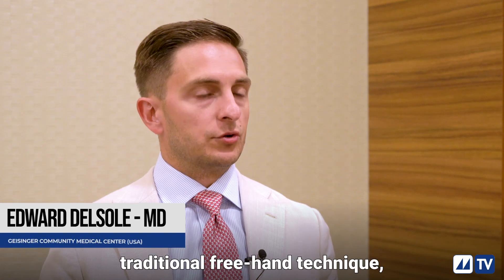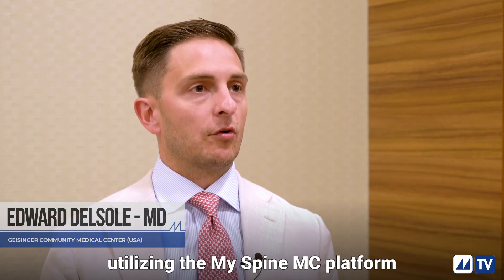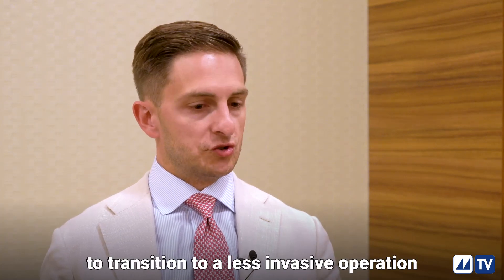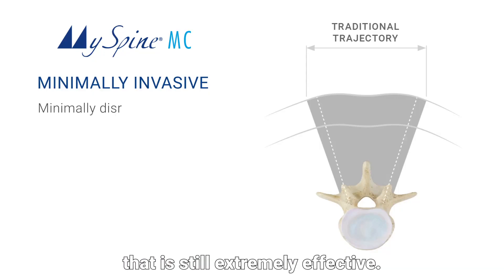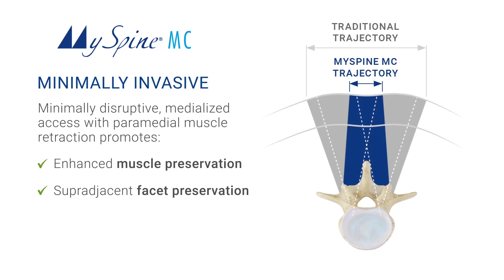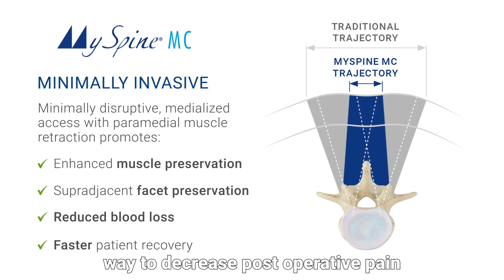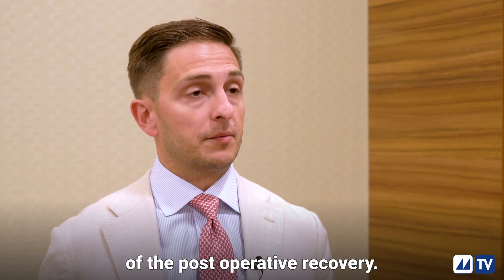I think instead of an open traditional freehand technique, utilizing the MySpineMC platform is an ideal way for a surgeon to transition to a less invasive operation that is still extremely effective for dealing with all degenerative pathologies. It is a way to decrease your blood loss, decrease postoperative pain, and increase the speed of postoperative recovery.